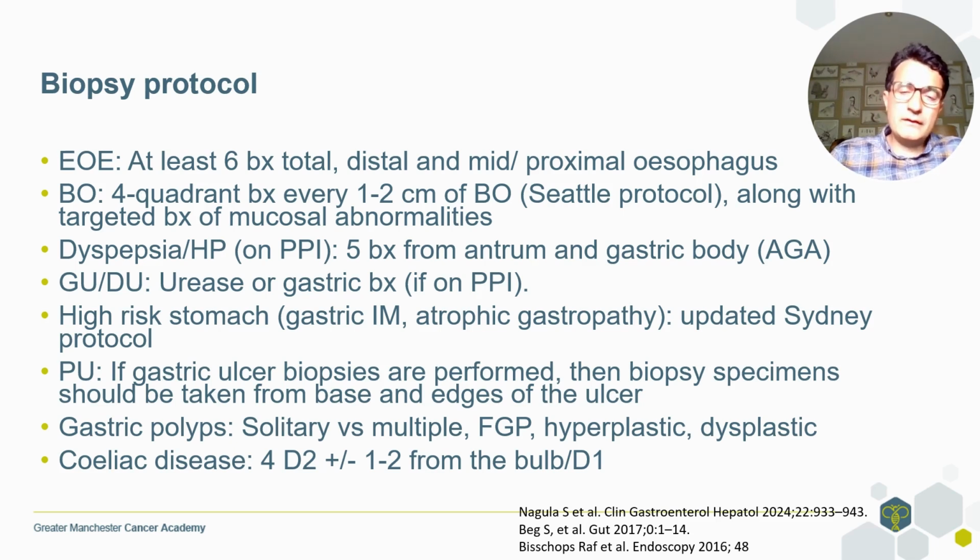If there is suspicion of any dysplasia or in fact hyperplastic polyps, they should be biopsied. If there are numerous, then representative biopsies of the larger polyps are adequate, but any dysplastic polyps should be biopsied with clear description of the location and Paris classification.